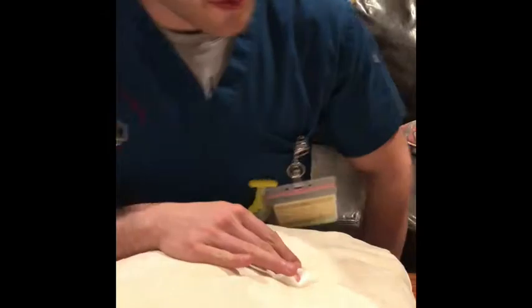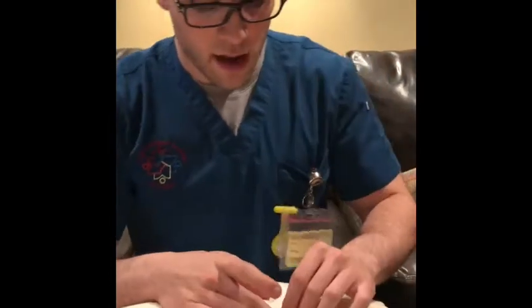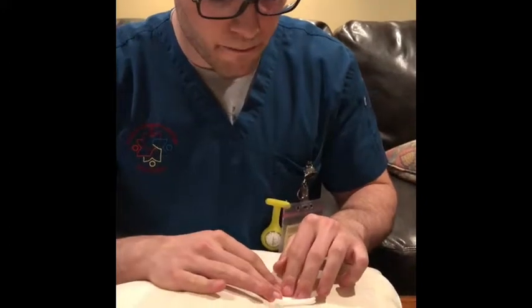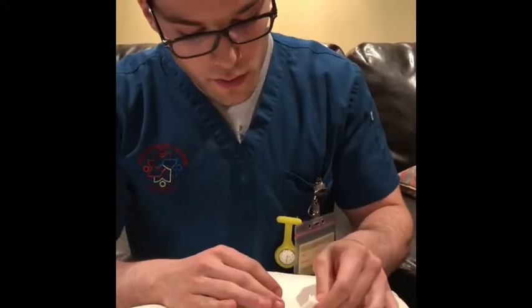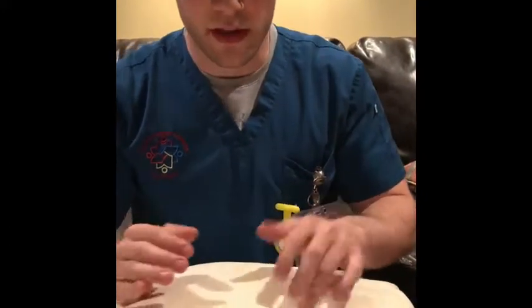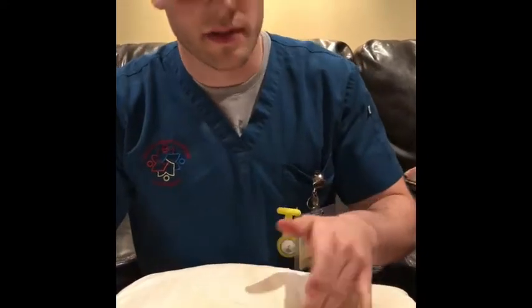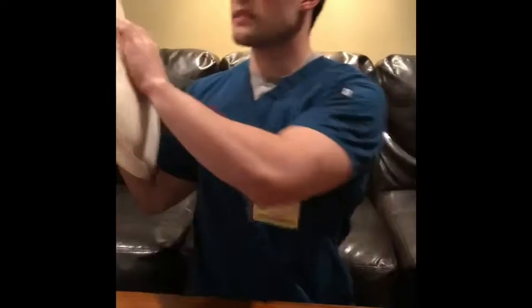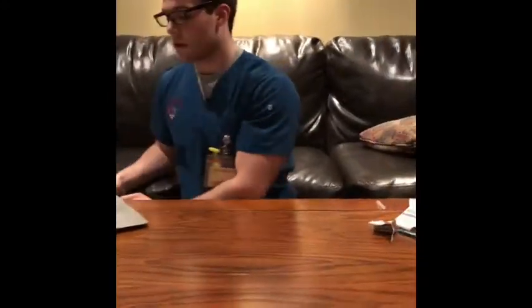And then I could also gauge the patient on how they were feeling, just to make sure there were no issues, or like for the umbilicus when we were avoiding vessels, that no vessels were hit. So that was for subcutaneous, and now we will prepare for the intramuscular injection.